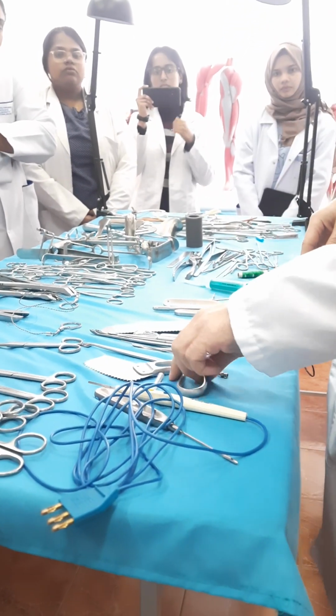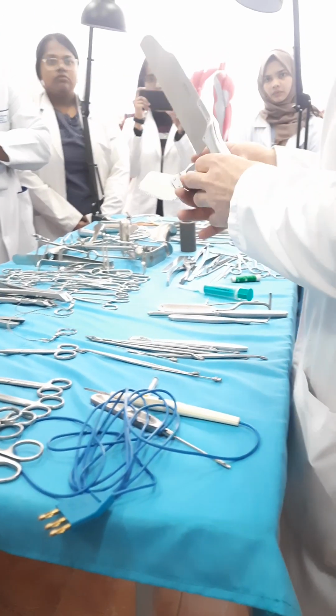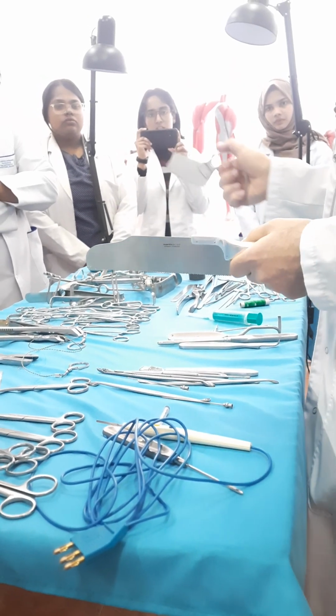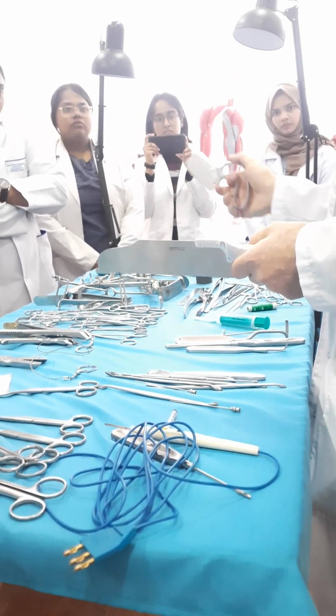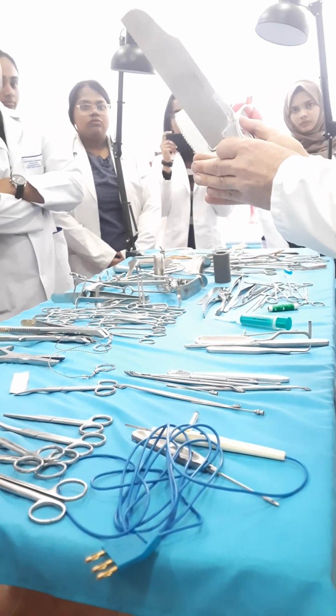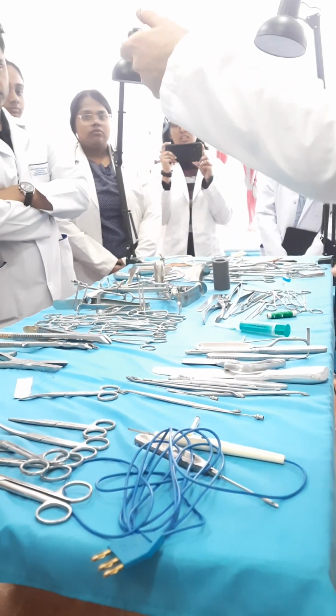Let's continue. The next instruments, of course, are saws. There are different kinds. The tool which you see we call a hand saw. It has a big body and handle, and you can make an incision only in one direction. If you start it, you cannot change anyhow, because the bone will press this instrument. That is impossible. The second type of saw which we have is the wire saw.